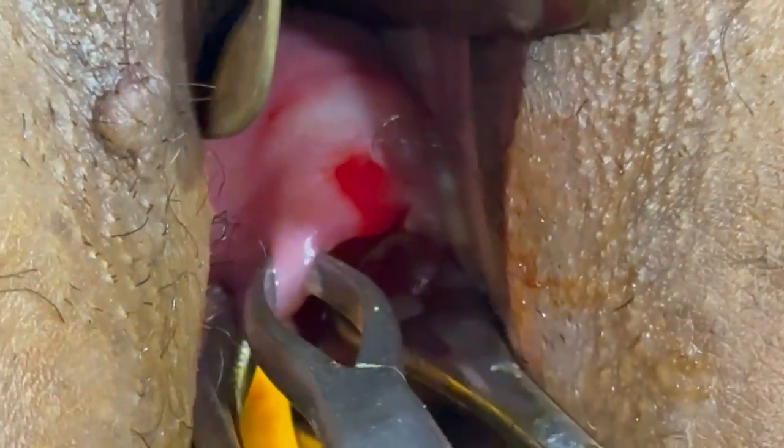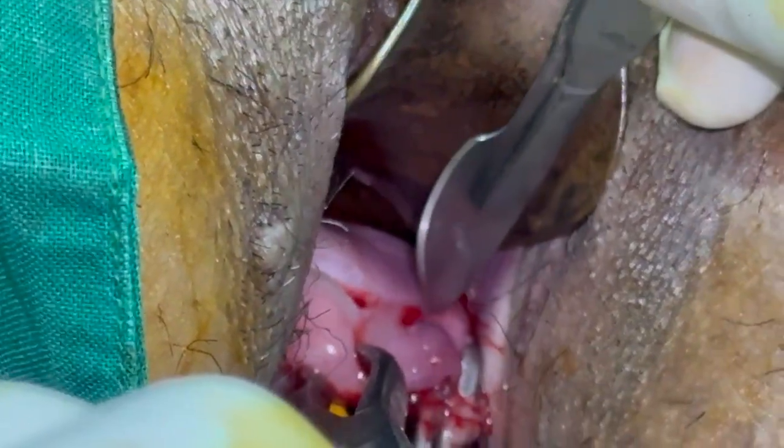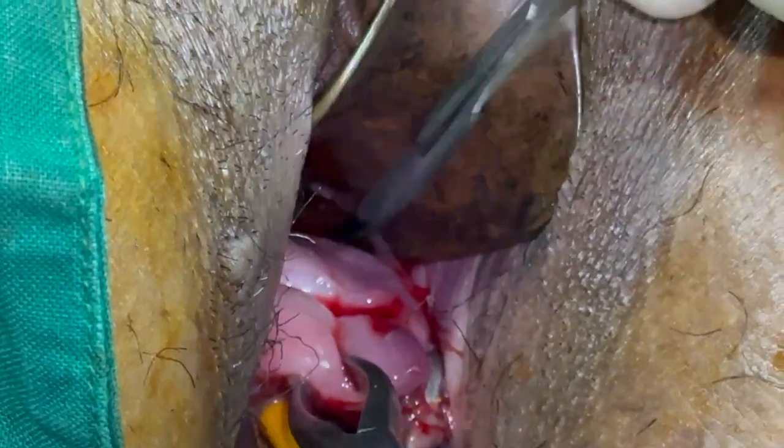At the incision site we are injecting plain normal saline, and then the incision was placed on the border of the cervix and vagina, and then it was extended laterally. Before that, as you have seen already, we put a Foley's catheter and placed the membranes back into the uterine cavity, and we have kept that Foley's in situ.